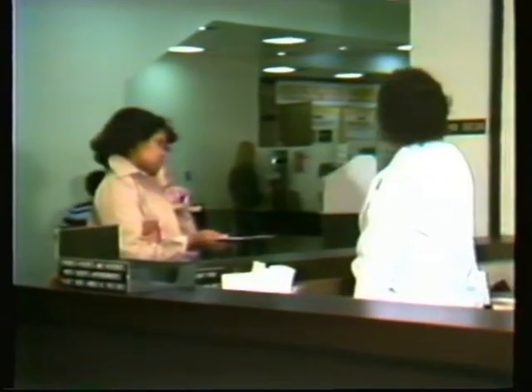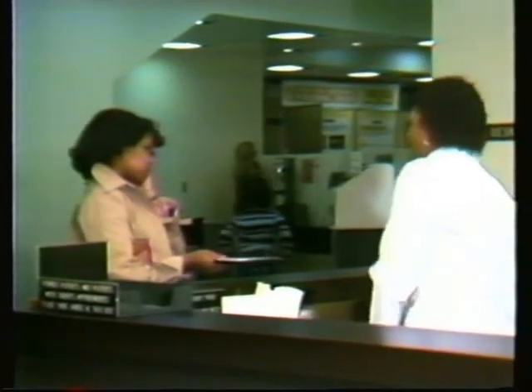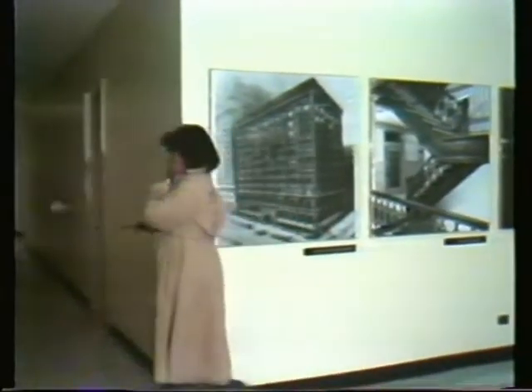After you have seen this program, and before you are allowed to treat patients in the oral surgery facility, you will have to pass a short quiz. Some of the questions will be based on the material in program 1 and 2, while others will test your ability to identify some of the errors in program 3. After you've taken the quiz, we will view the program again and point out the errors. You should be aware that errors in technique, procedure, and interpretation are present throughout this program. While some errors would normally stop a procedure immediately, for educational purposes, please assume that the error has been corrected as the program proceeds.